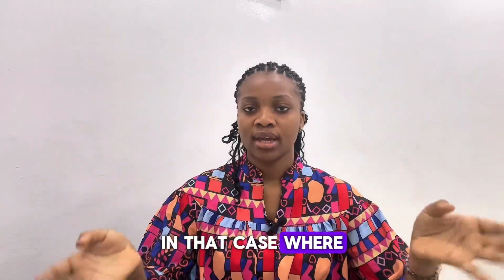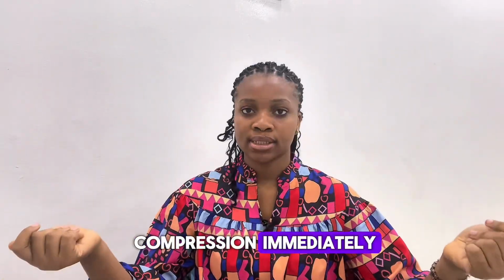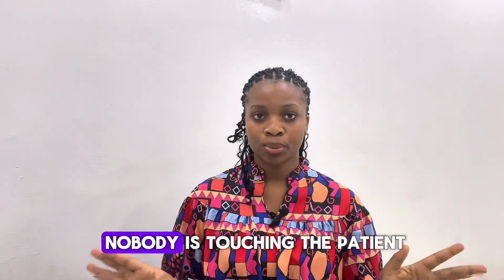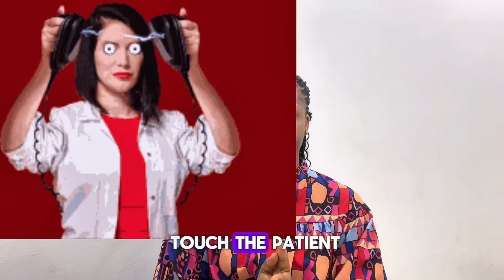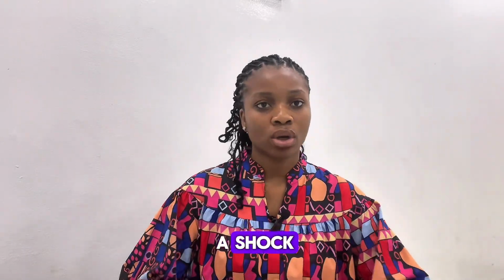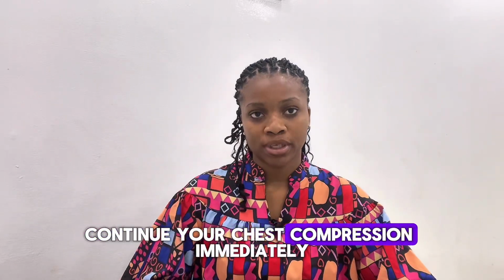In the case where the AED does not advise any shock, please continue your chest compression immediately. If this AED advises shock, please make sure that nobody is touching the patient, including you. Current may transfer to you. That's why nobody should touch the patient, and make sure the environment is not wet. So once you deliver a shock and the AED does not advise any other shock, continue your chest compression immediately.